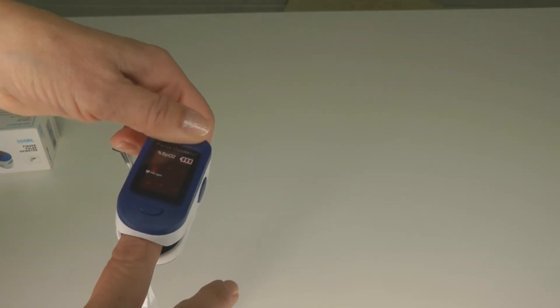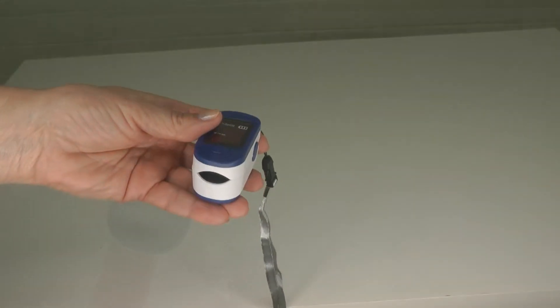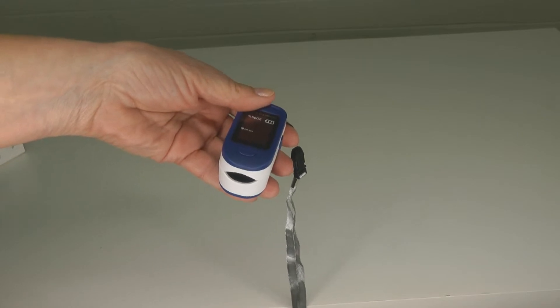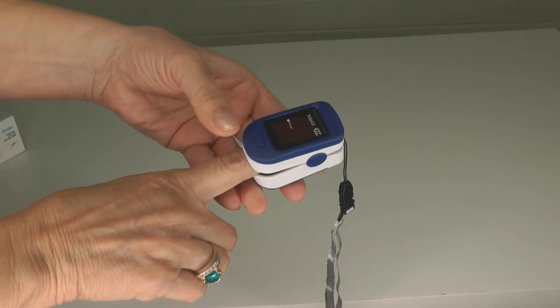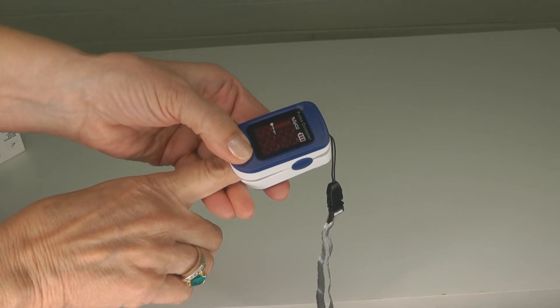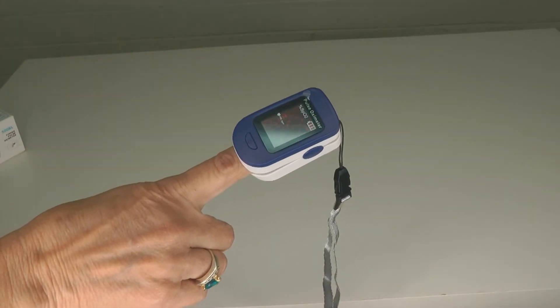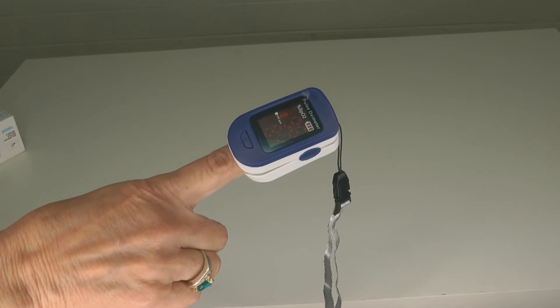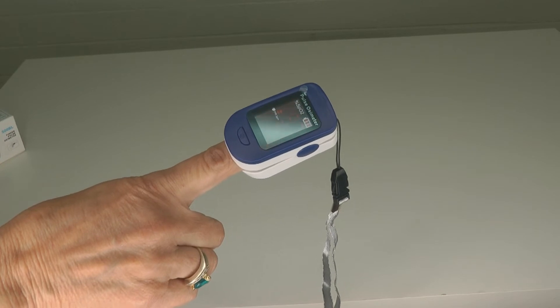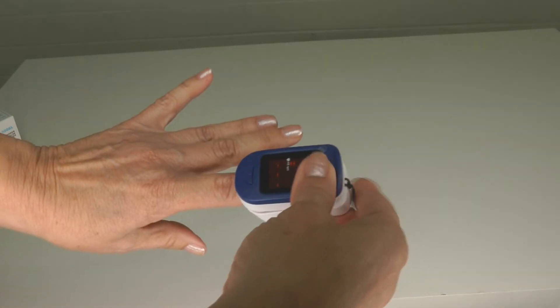It's not like a clothespin — it doesn't hurt at all. It's completely non-invasive; it's just measuring the oxygen and your pulse. The included directions are detailed and clear. Keep your hand and fingers still for the reading. It's recommended that you do not move your body while taking the reading. The measurement will be displayed on the screen.